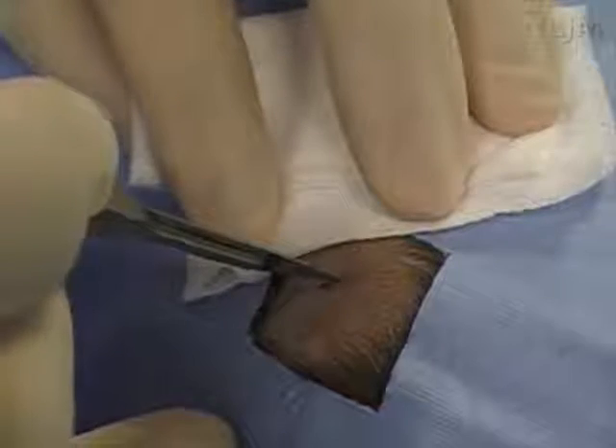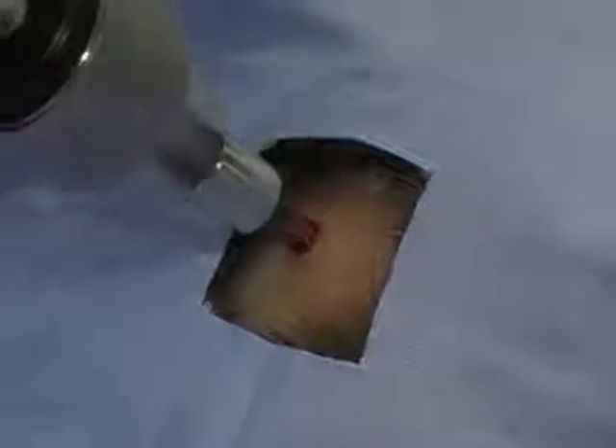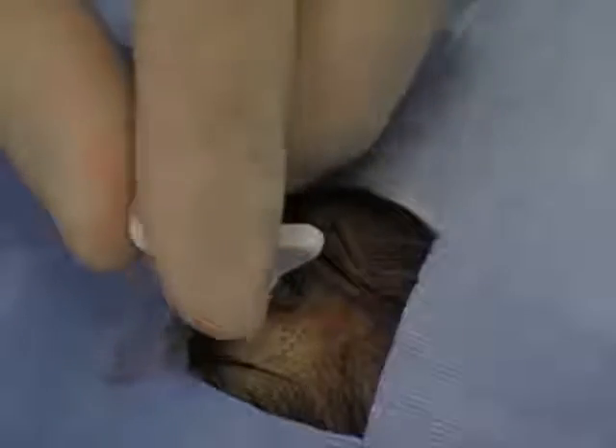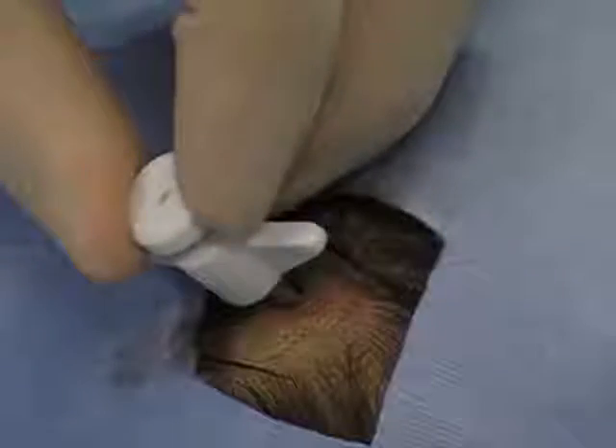Make a short 5mm linear stab incision; use of a retractor is usually unnecessary. Ask an assistant to secure the patient's head. Place the drill perpendicular to the skull and turn the handle clockwise — do not lean on the drill. You will usually be able to feel the drill bit penetrate the hard outer cortex, the soft central medulla, and the hard inner cortex. Place the bolt in position perpendicular to the skull and turn it clockwise, usually nine half turns until it is secure. Loosen the cap of the bolt by turning the adapter counterclockwise and make a puncture in the dura using the dural puncture stilette. Cerebral spinal fluid may be visible at this point.